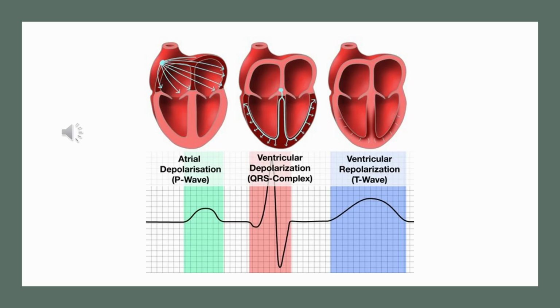All right, so this is just an image that kind of breaks down all of the different components of the ECG that we just talked about. So here we can see a representation of how the electrical activity of the heart corresponds with the actual mechanical function, or what's actually happening in the heart, as well as how these phases occur on the EKG. So breaking down these EKG or ECG phases.